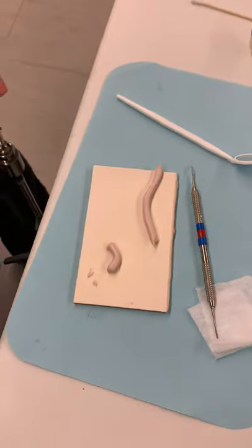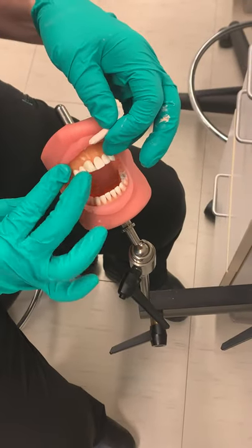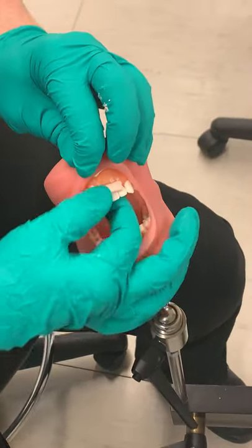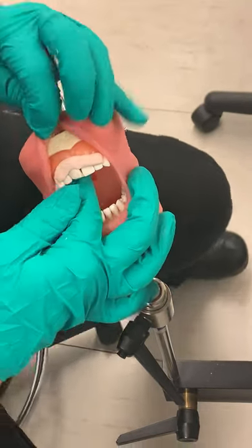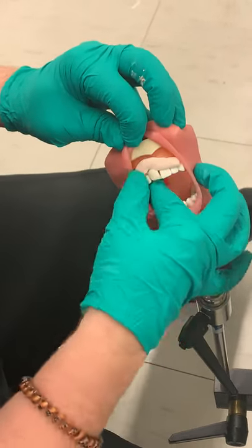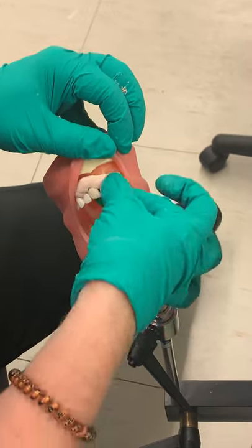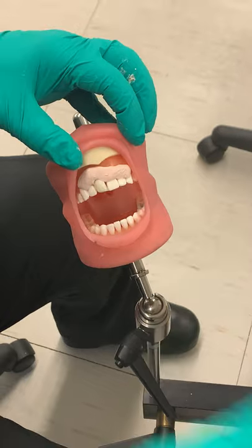The first worm I'm going to take — remember this is our surgery site — I want to go a tooth and a quarter, so from about right here over to a tooth and a quarter right there. I like to use my hands a lot to shape this down and press it on. Sometimes I use a little water so my hands don't stick. That's the facial side done.